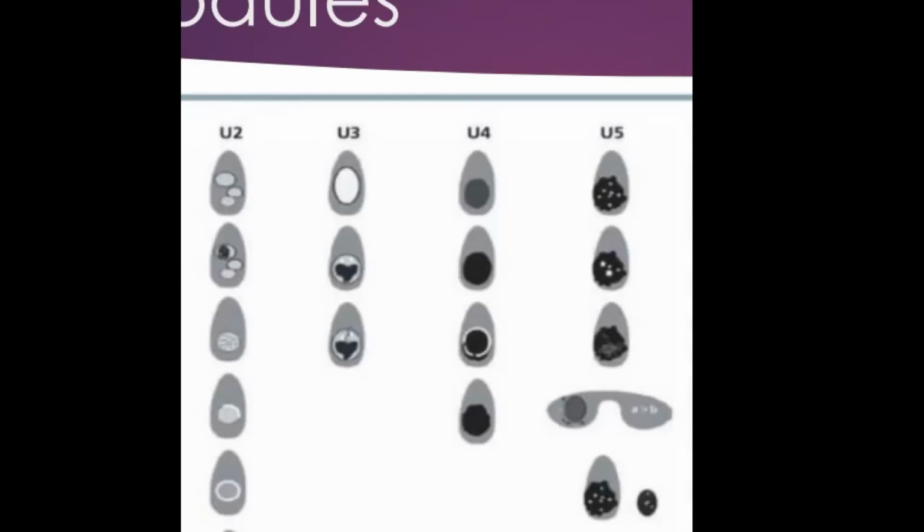So such nodules, depending on other history or other clinical relations, we will put it up for either follow-up scan in 2 months, or we do a biopsy. We often opt for biopsy, unless the patient is needle phobic, then we can give them some time to think about it. That way we can do an interval assessment to see if there's any change.